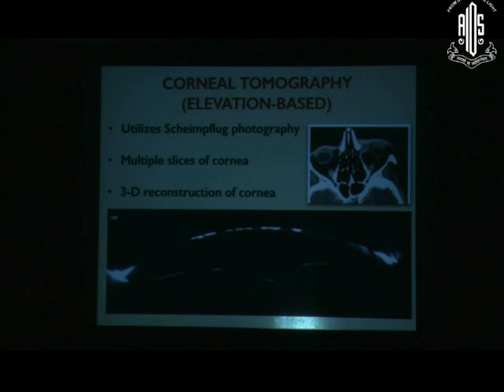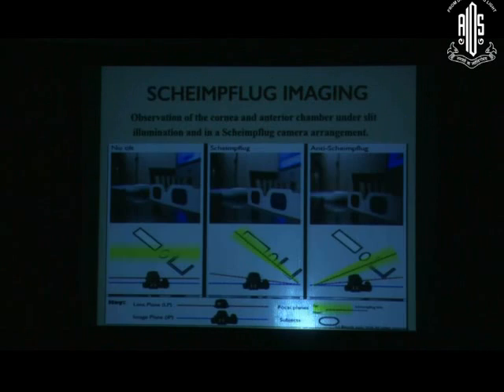So it uses Scheimpflug photography, and we see that it takes multiple slices of the cornea, similar to how a CT scan machine works. The CT scan machine in neurology, so it reconstructs all these slices and gives us a three-dimensional reconstruction of the cornea.